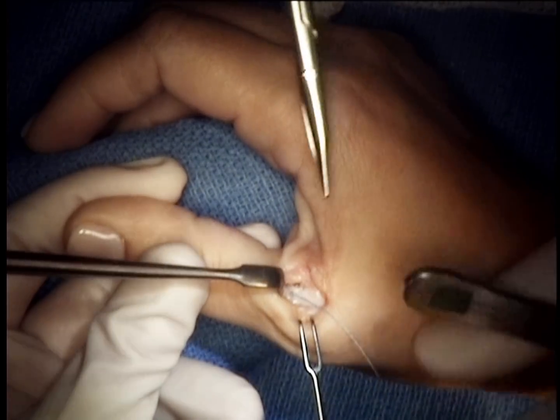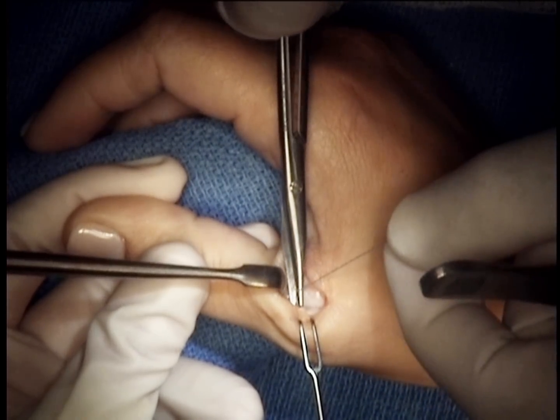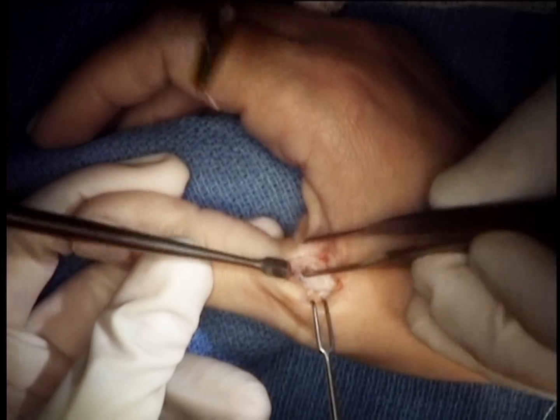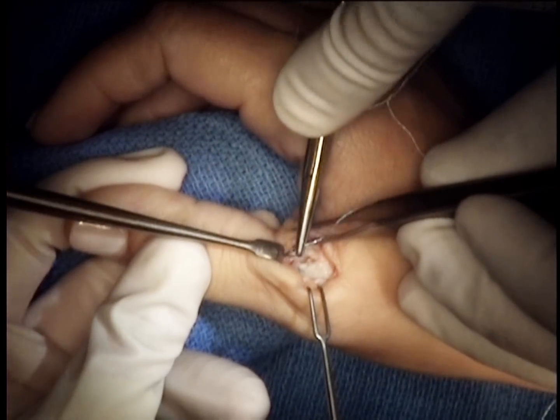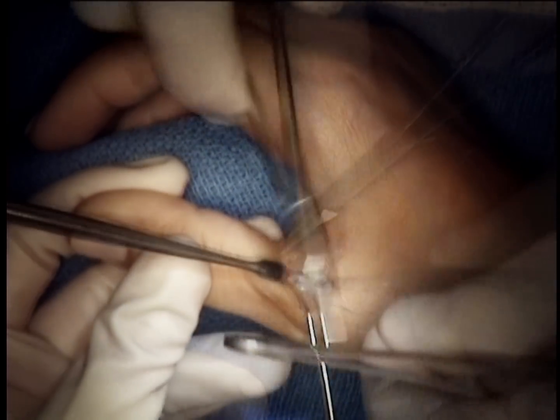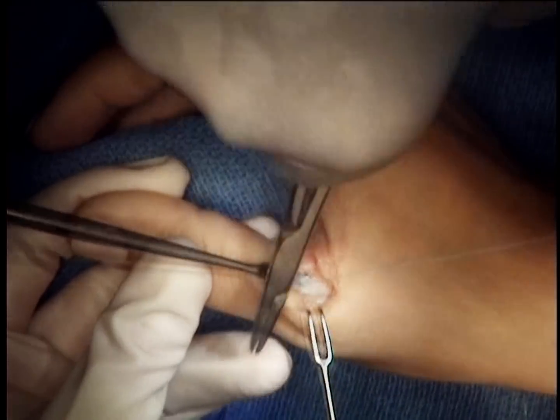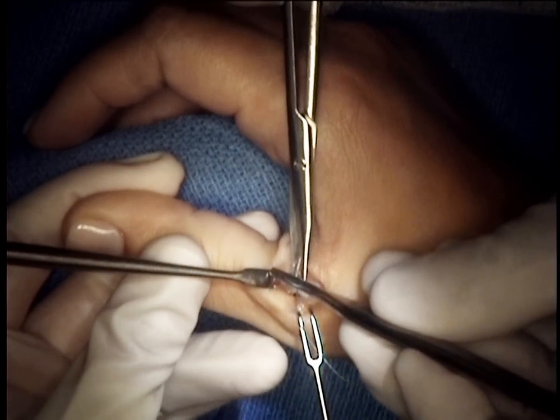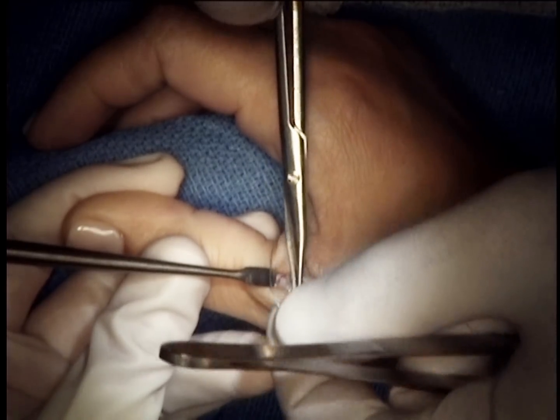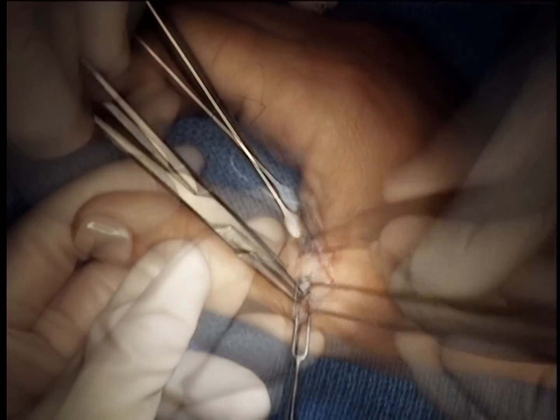Many times we will add additional suture, particularly dorsally, to provide a bit more strength. In this case, we also repaired the capsule because of the quality of the ligament, which gave some augmentation to the repair. Once this is done, we can stress the area and ensure that the collateral ligament is anatomically playing its function.